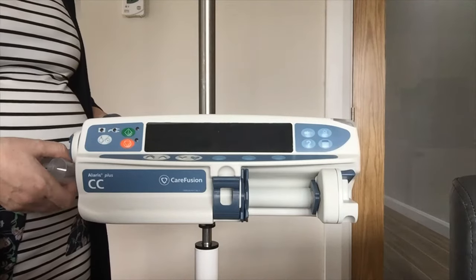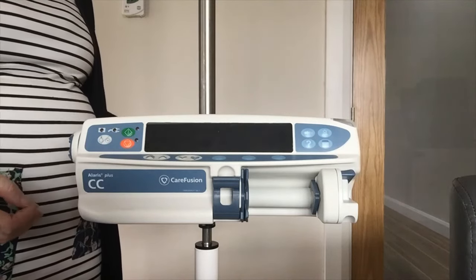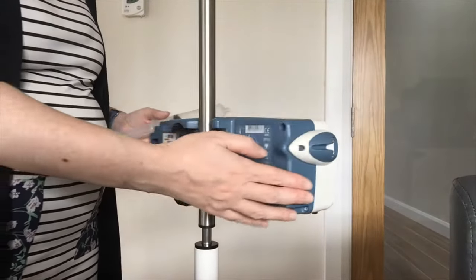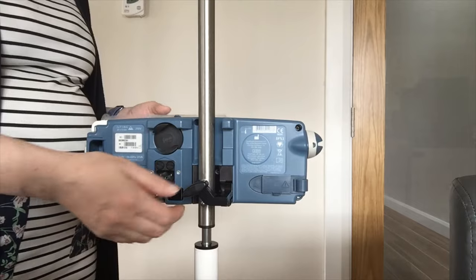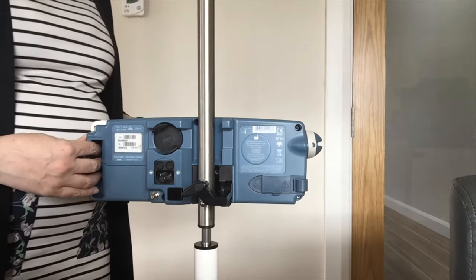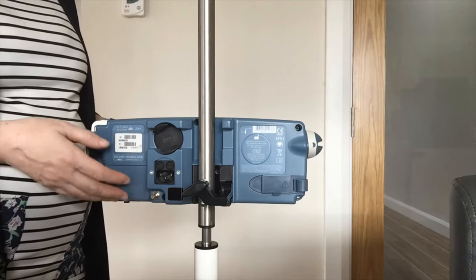Before setup of the pump, just make sure they are clean, intact, and there are no cracks or any fluid ingress. On the back of the pump you will see that it attaches using your integrated pole clamp onto your IV stand. You have got your handle here for carrying or transporting, and you have got your socket for charging.